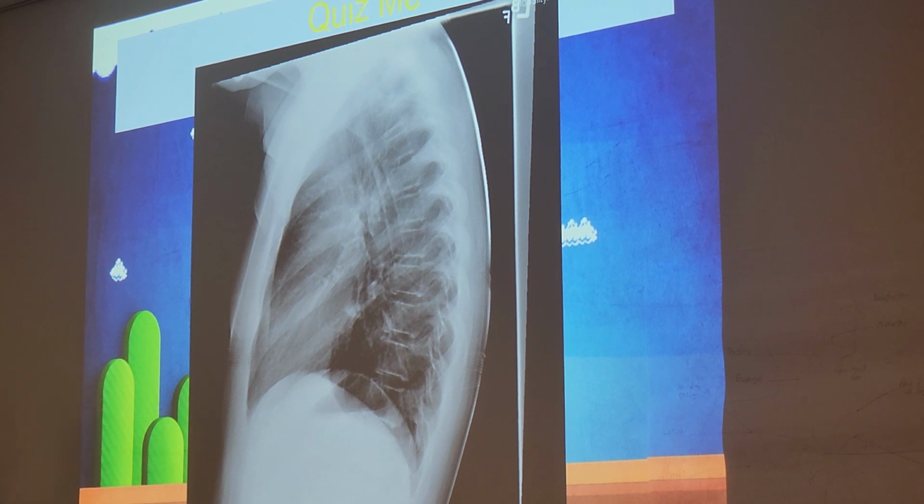What else? Someone said artifacts. Where are the artifacts? It's kind of like a sports bra, like a band. Correct. Sports bra, elastic bands, right there. Big no-no. Anything else? The marker is on there, technically. Not in the best spot, but it's technically on there. Is there tilt? Like they're leaning down. Probably hard to tell. That's possible. The chin is in the picture. The main two, of course, are going to be the rotation and the artifact.